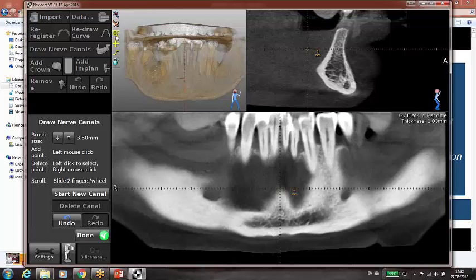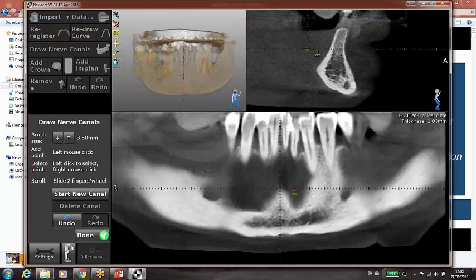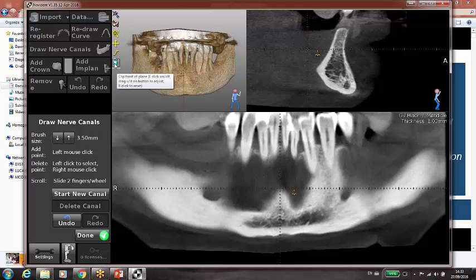So you can also see here a magnifying lens. If you click on the lens and you move the mouse up or down, you get a bigger or smaller picture. If you see here, there's an S shape symbol. If you click it and move it, you can increase the density of the bone. And there's a last icon on the bottom. If you click it and keep moving, you can open up the anatomy. So that's the function on the 3D.